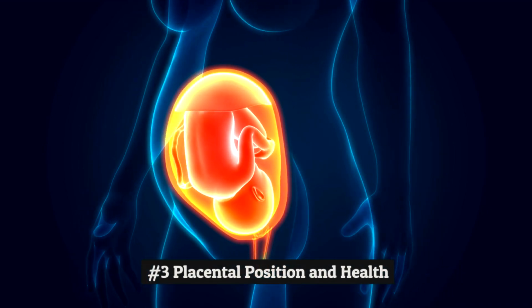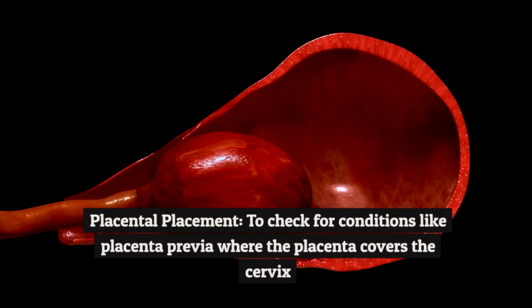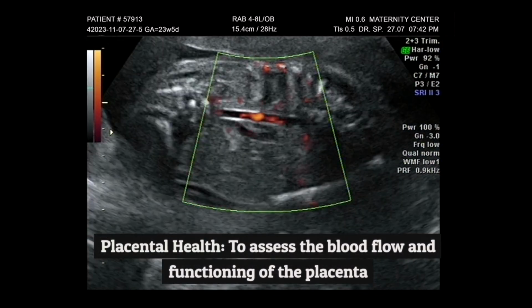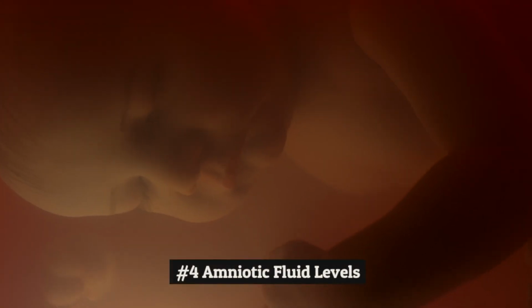Number 3, placental position and health. Placental placement, to check for conditions like placenta previa where the placenta covers the cervix, which may affect delivery plans. Placental health, to assess the blood flow and functioning of the placenta, ensuring it is providing adequate nutrients to the baby. Number 4, amniotic fluid levels.